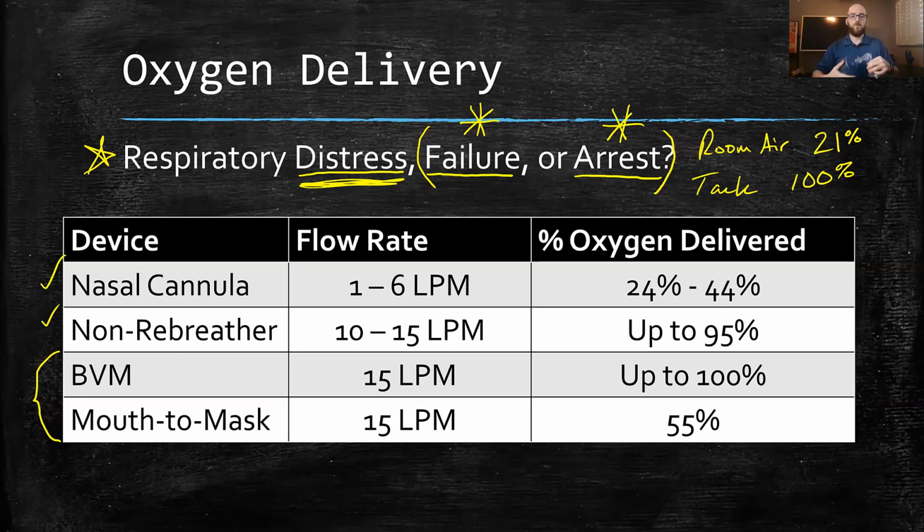Okay. So the bag valve mask is the BVM, which is bag valve mask. We will set to 15 liters per minute, high flow oxygen. And this is saying we're going to get up to 100%, because now we actually have this face mask that we're really going to press down on that patient's face, and the pliability of that mask is going to really form a good face to mask seal, so that we're not going to actually pull in any sort of outside air.